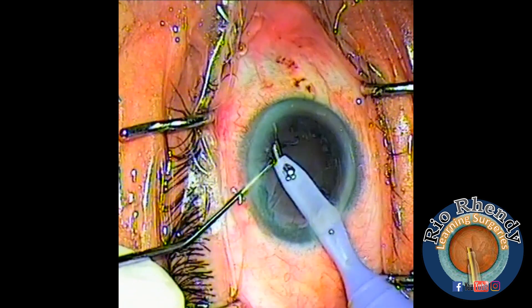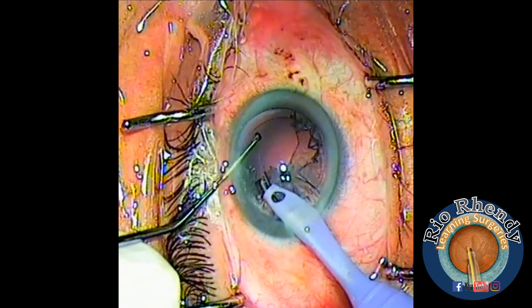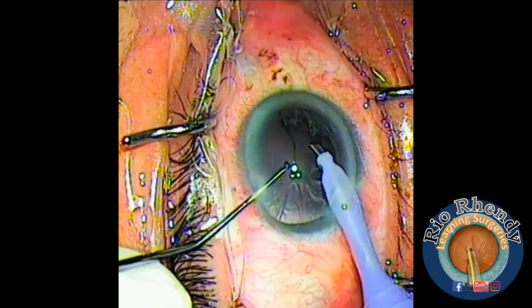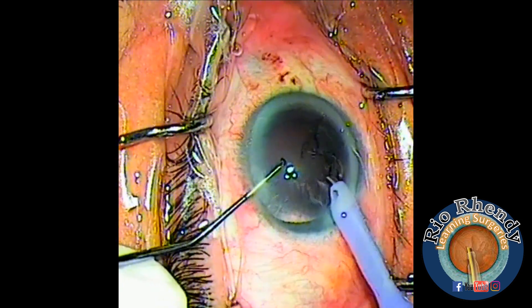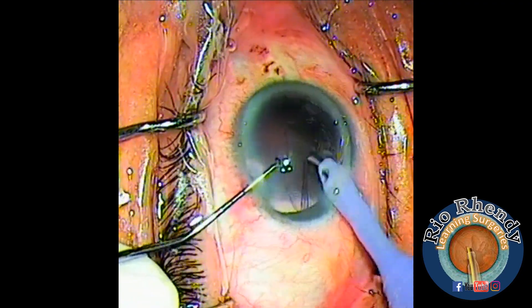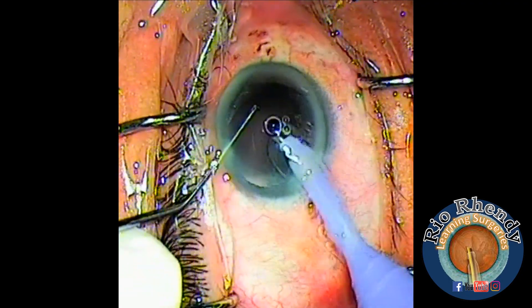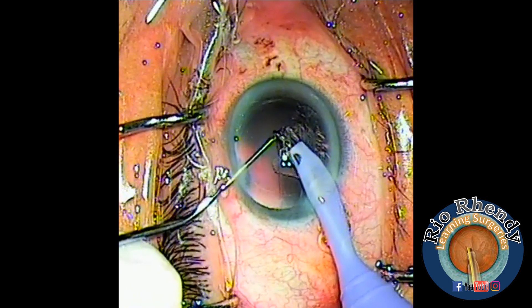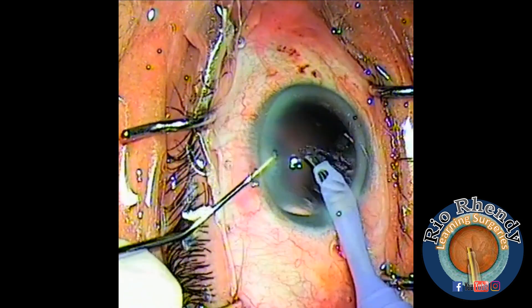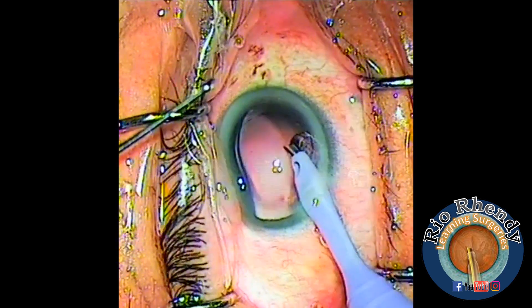For cortex removal, you can use vacuum but you have to be very careful because it's easy to make a rupture — push the pedal gently. There's a bubble, so remove the bubble first, then continue the I/A cortex removal. If you're not confident with this technique, use the I/A tips instead.